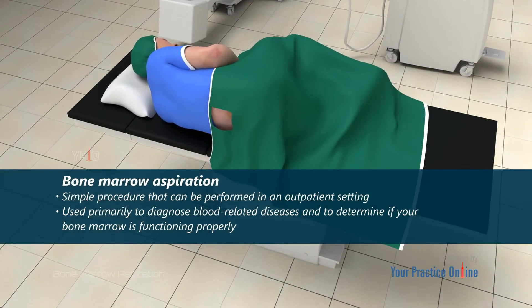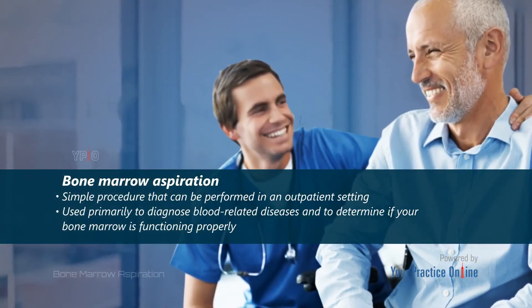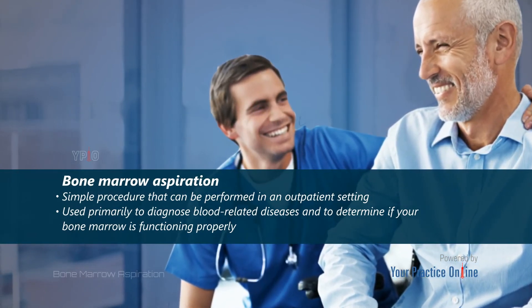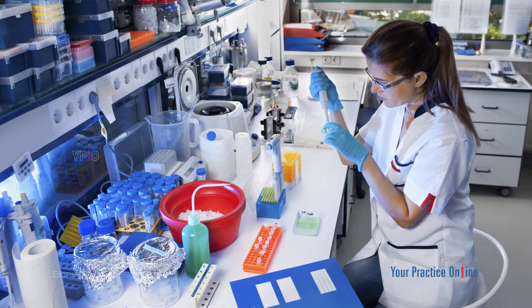Bone marrow aspiration is a simple procedure that can be performed in an outpatient setting. It is used primarily to diagnose blood-related diseases and to determine if your bone marrow is functioning properly. The sample of bone marrow will be tested by a pathologist to help establish a diagnosis and select the most appropriate treatment.